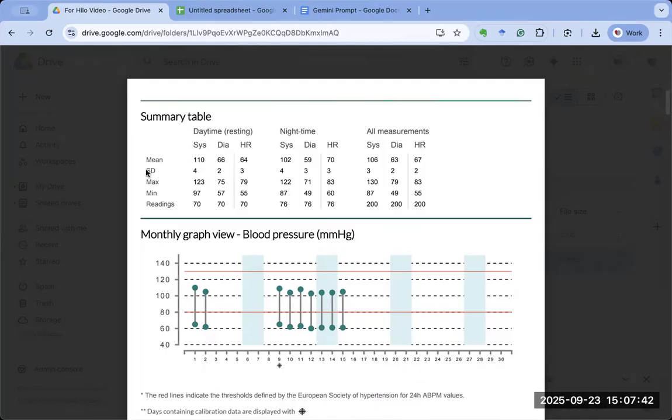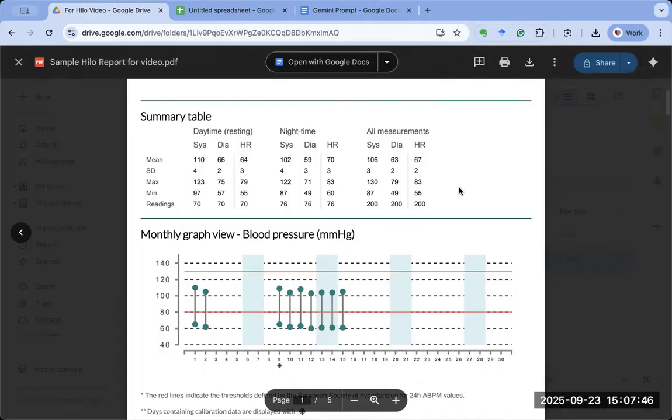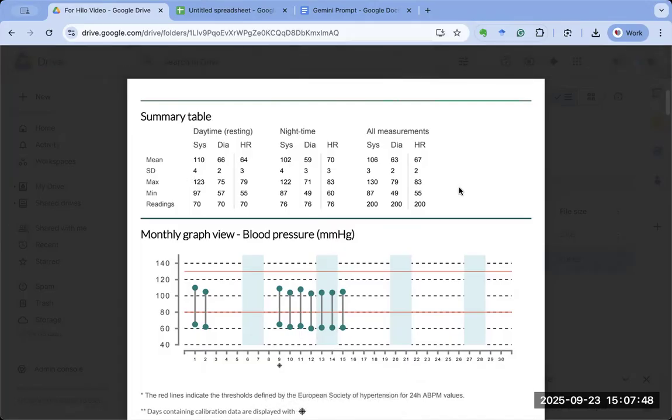Right now, I would say just ignore it for now, because blood pressure variability means if your blood pressure goes too high or too low, both of those are not very good. But what is the accurate number? What is correct? What is important? Because men and women have different blood pressure variability and heart rate variability.